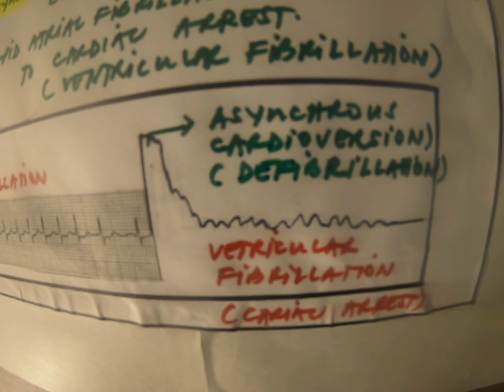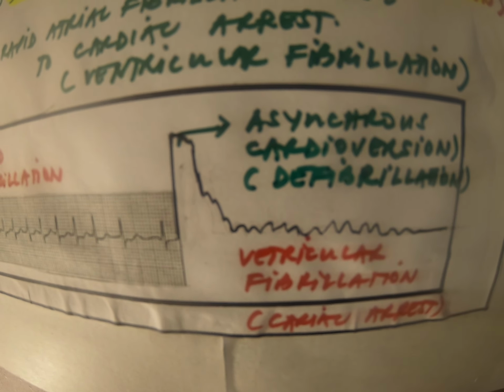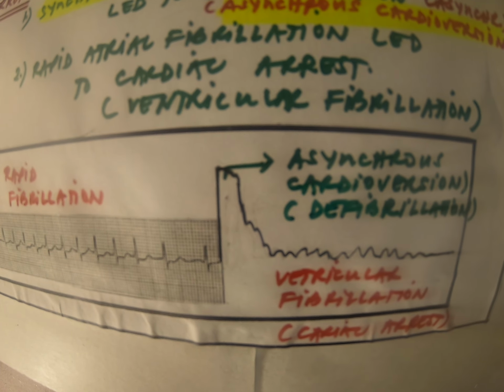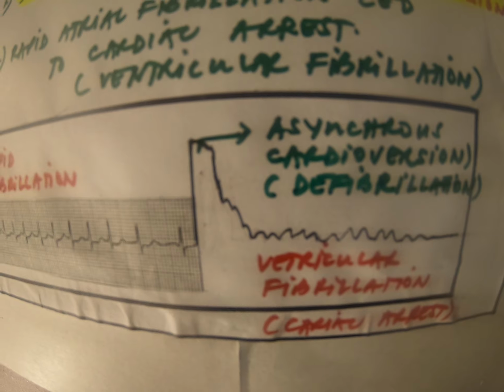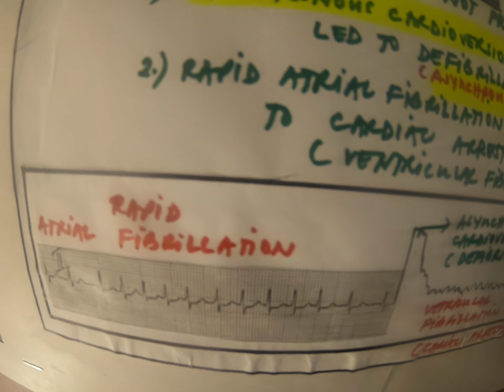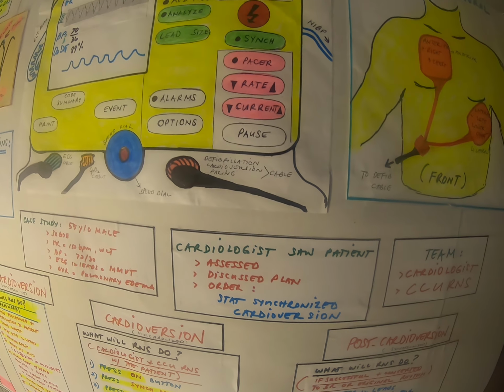And if this happens, don't waste time. Just go and defibrillate the patient. Okay, but I'm saying it might possibly happen that somebody forgot to press the sync mode, and this is what's going to happen. So we have to be very careful and watch for that.